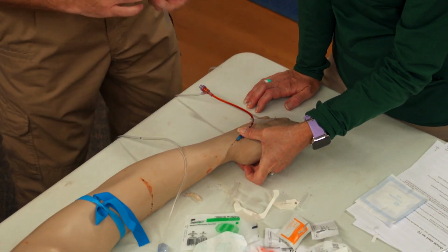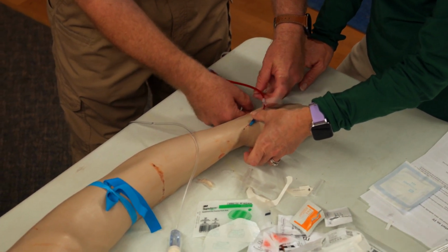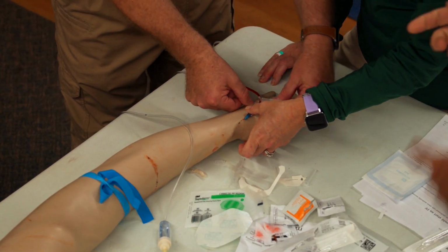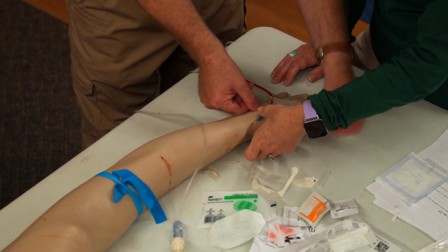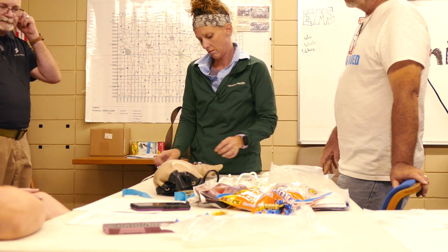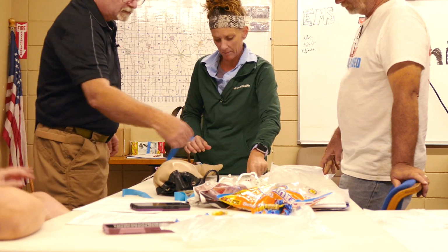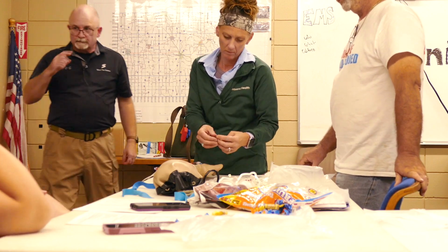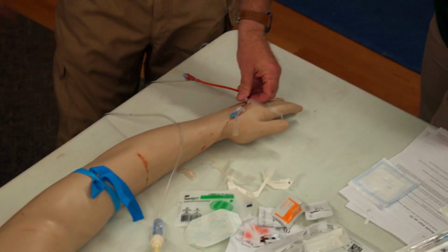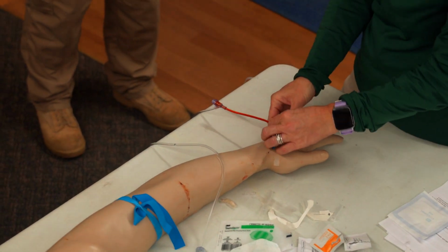So I would start with it up. Again, you're trying to do this one-handed and stuff. So I would do this, and then tape it down. That was old school, up over the hub I was pulling out. And then another one, and then another one, and whatever. But with the Tegaderm, I get a lot better. Super. So, yep, there you go.